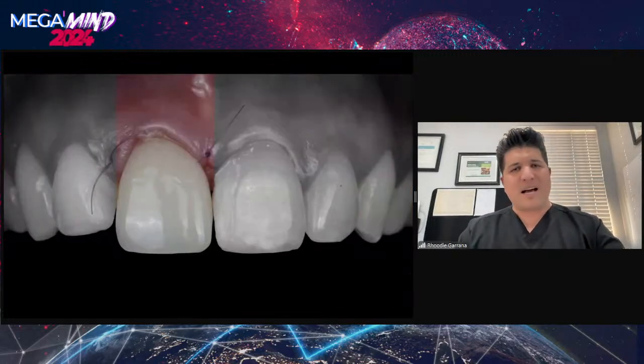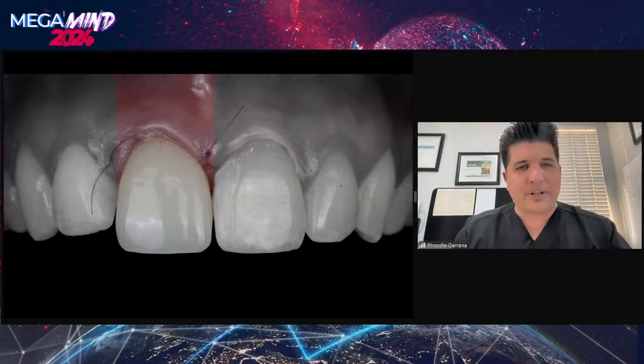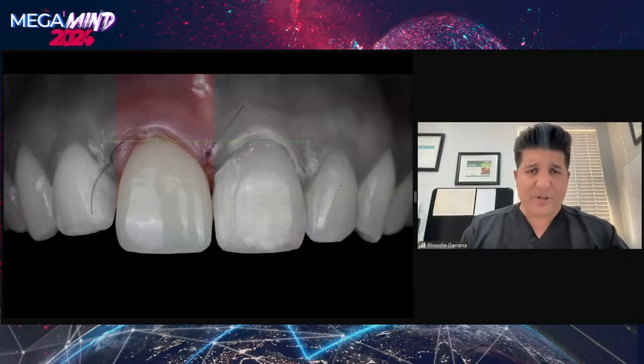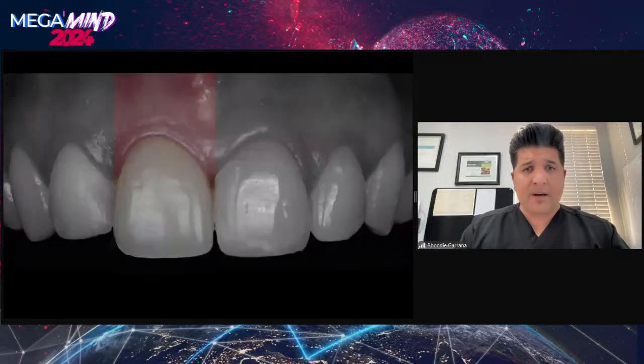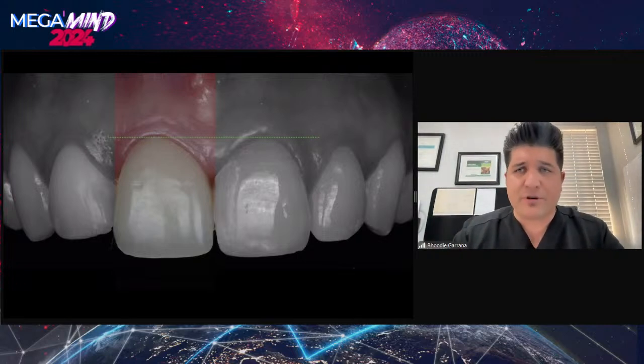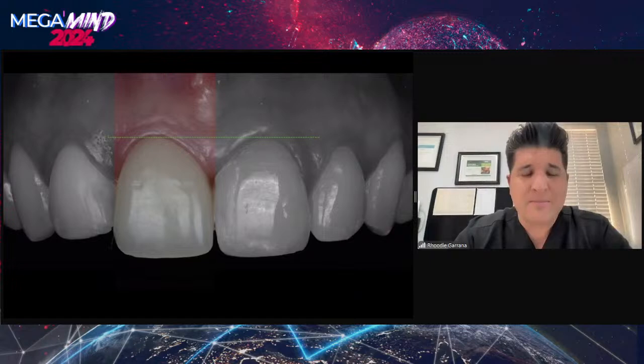And this kind of just reiterates that we've achieved what we wanted to. If you have a look at the time of placement of the provisional, which is 24 hours after implant placement, if we use a reference and we can see where the gingival margin is compared to after healing, we can see that there's been a coronal creep of the soft tissue. And this is very thin soft tissue, but we can see that there's been a coronal creep of this tissue.